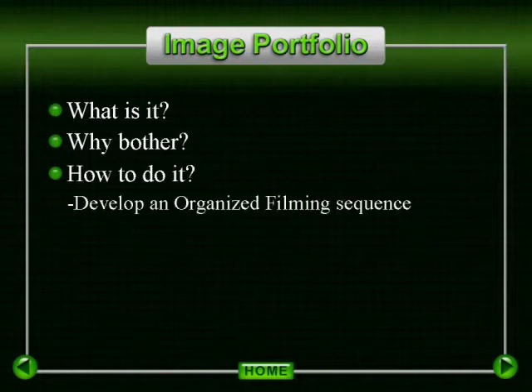First, you need to sit down and, utilizing your approach to image interpretation, develop an organized filming sequence for significant images. Bear in mind that this sequence should be agreed upon by all radiologists involved in interpreting breast MRI. You don't want to have a different viewing format presented to the referring physicians depending on which radiologist performs the interpretation.